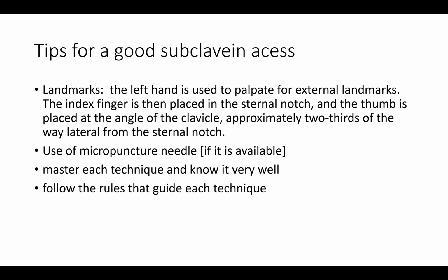So what are the tips? The landmark. You must learn the landmarks. You must know the landmark, and you must feast your eyes on the landmark. Then two, the use of micropuncture needle. In the US, that is what they use.